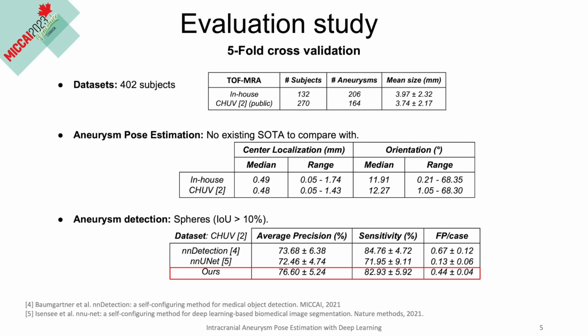For instance, in the public dataset, our method demonstrated a median localization error of 0.48 mm and orientation errors of 12.27 degrees.